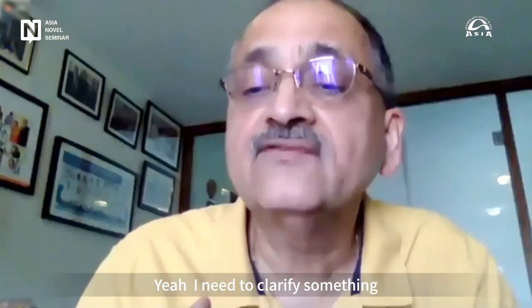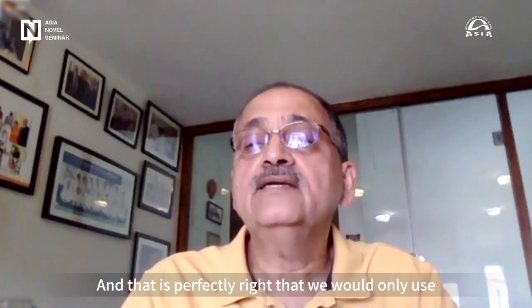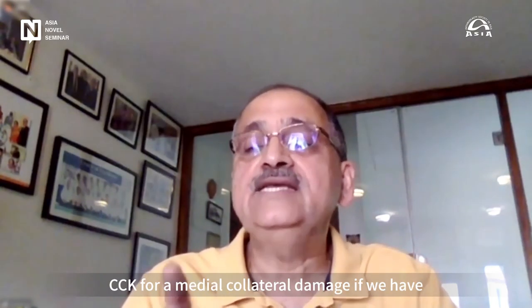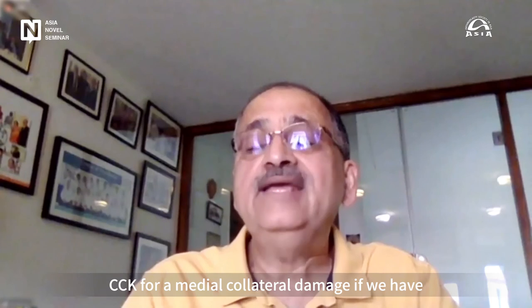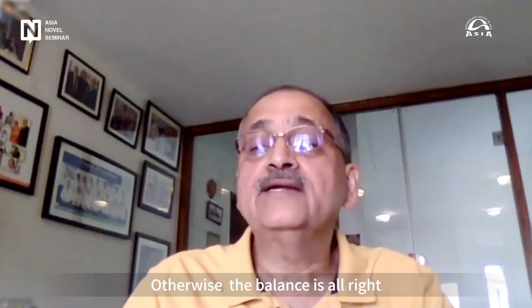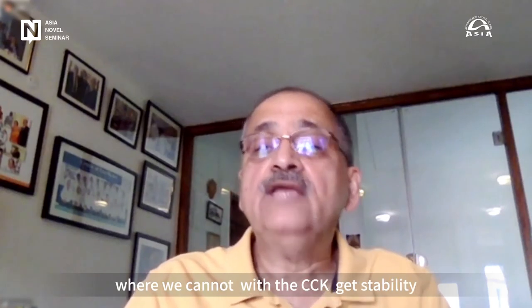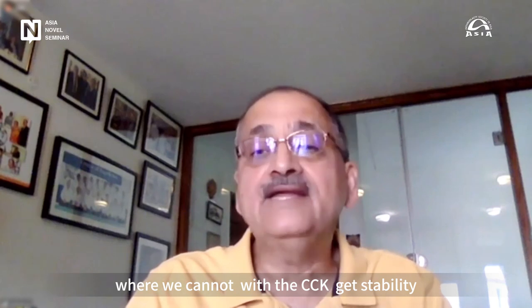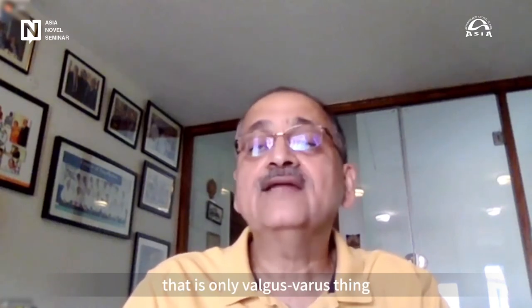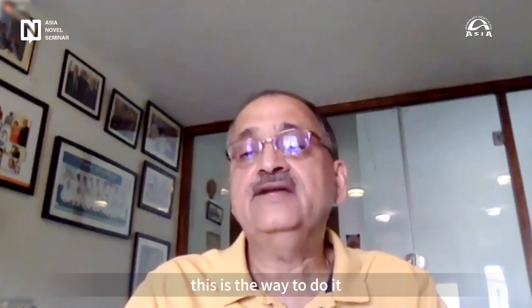Yeah, I need to clarify something. I totally agree, and that's perfectly right, that we would only use a CCK for a medial collateral damage if we have otherwise the balance all right. But if we have a floppy situation where we cannot get stability with the CCK, that is only a varus valgus thing. So yes, I agree with Professor Barrett that this is the way to do it.